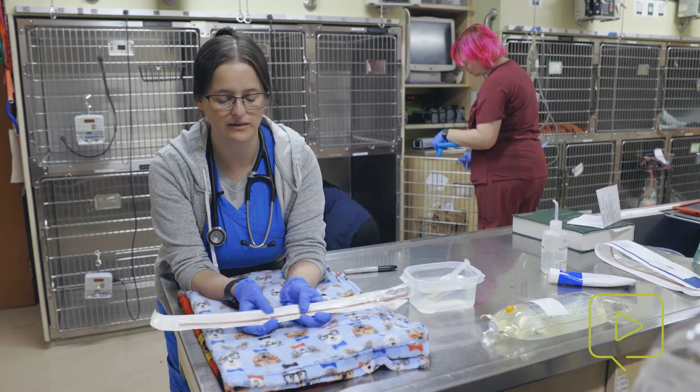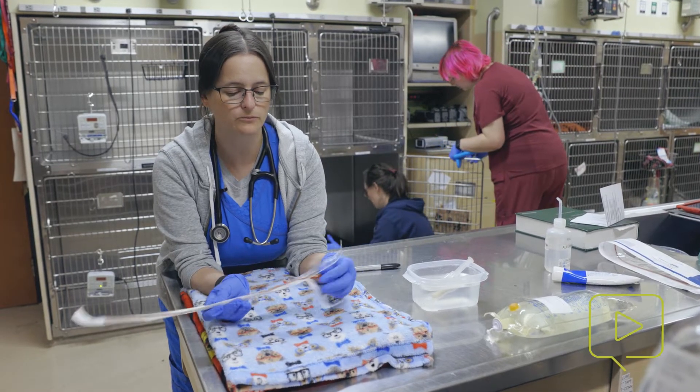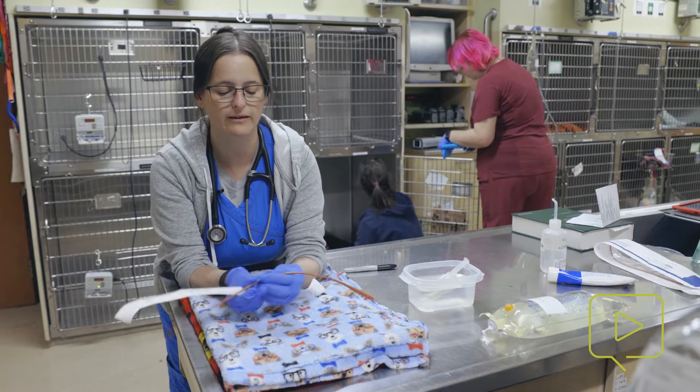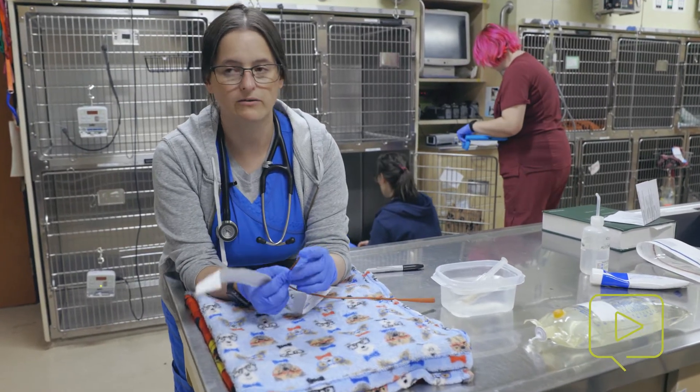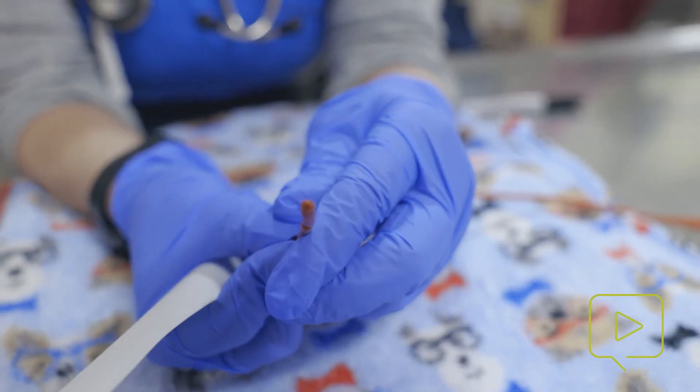For our particular little puppy, we've got a 10 French red rubber. You want it to be a very soft and flexible tube, and you want to avoid, if you can, cutting the tube. These are rounded and easy to introduce without any trauma to the esophagus itself.